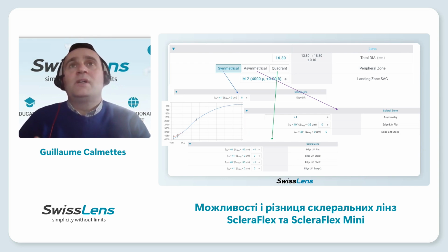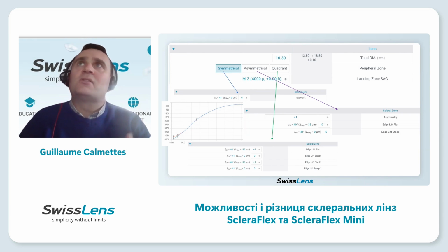And quadrant, we can see it's down on our screen. It's something like we can play with edge lift by quadrants. Does that mean you have one at 0, one at 90, one at 180, and one at 270? For some lenses or some patients, you have to play with that, because for pinguecula, or for scars on the sclera, it's very interesting to have the option to do something. The ScleraFlex Mini doesn't offer that option because it's limited in design.